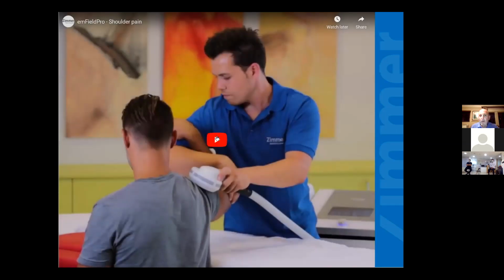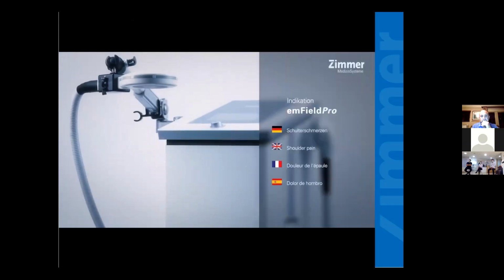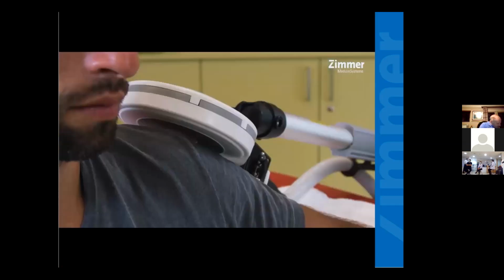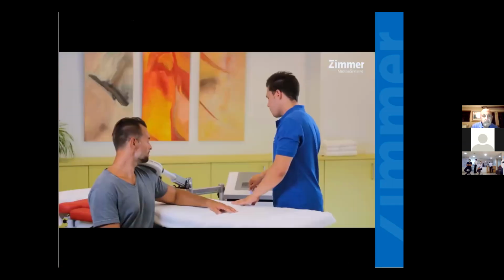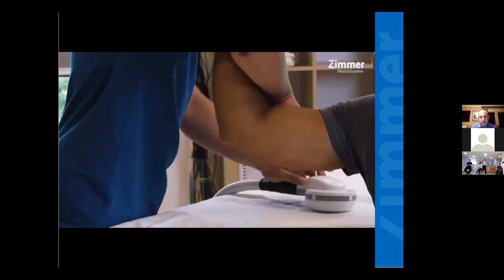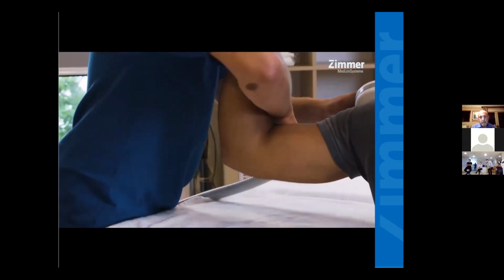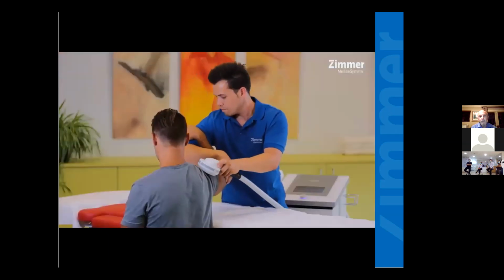How about a shoulder with some mobilization attached to it? Working some internal, external rotation.